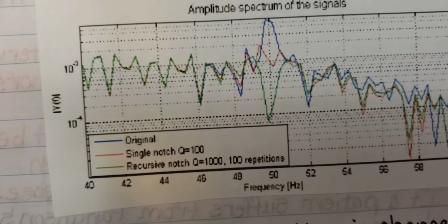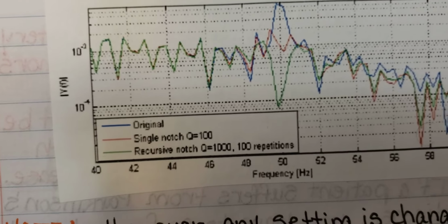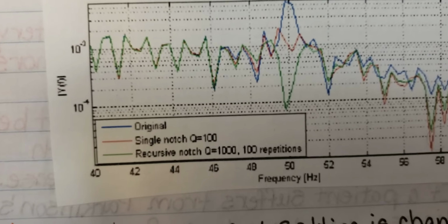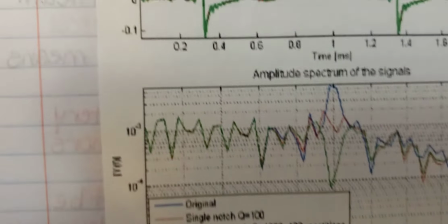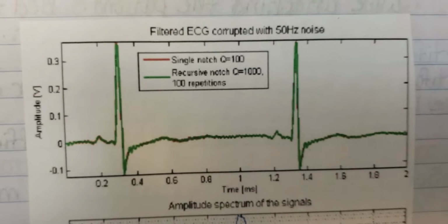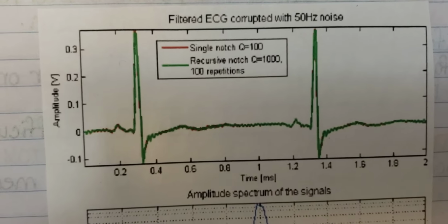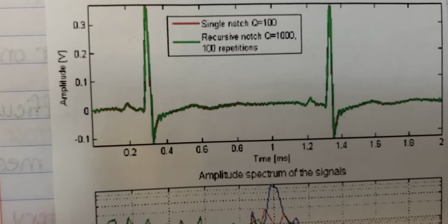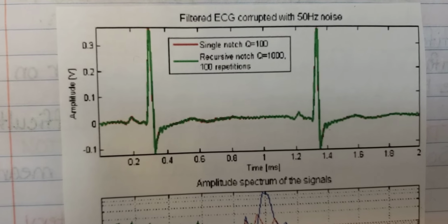And we really couldn't read where the QRS starts and stops because we have too much interference and noise. So when we put on the frequency response, we end up with a reading like this, where we can see where our PQRS are once we get rid of all the unnecessary noise.